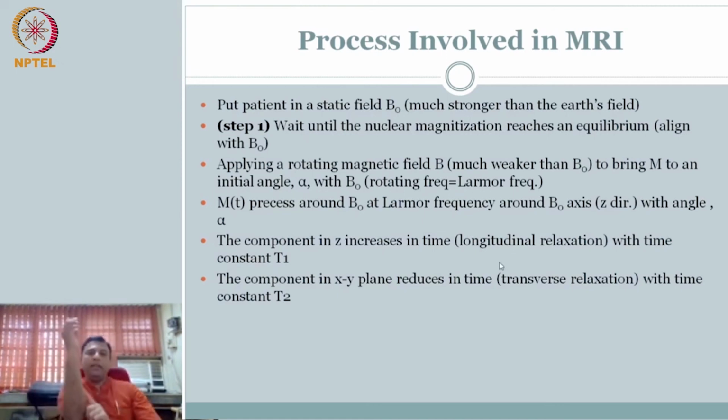So of course, just to complete the point, if I now say remove the external magnetic field, right? Now I say, oh okay, you all relax. What will you do? You'll go to your resting state, wherever it was. So that means if I remove the external magnetic field after I make you all obey the command, if I remove the command, how fast you will go to your native state is a characteristic of you, right? Some may go immediately, some may go slow, some may take their own sweet time, some may not go. Well, let's not take that case here. But the point is, you are trying to relax, right?